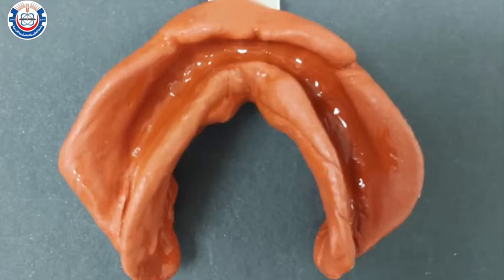The material of choice for this procedure is impression compound, also known as modeling plastic. It's a thermoplastic material supplied in the form of cakes, which we'll be using right now, or green sticks, which we'll be using later in the secondary impression procedure.